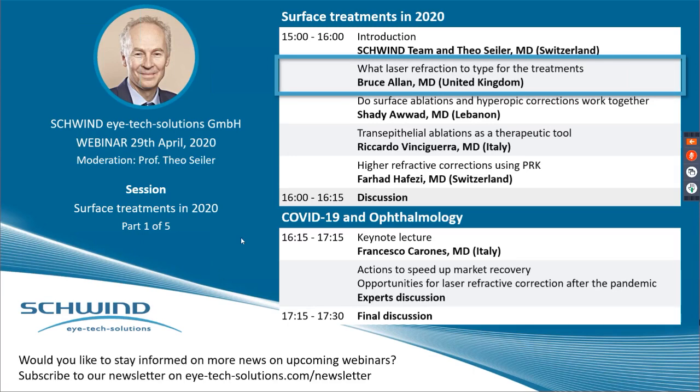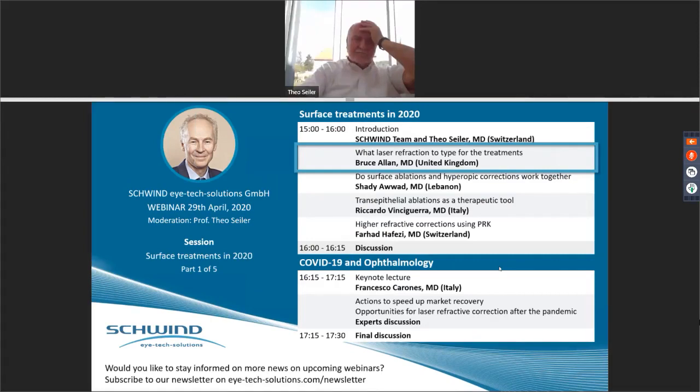So, Theo, I think that the point you just made is important. What we found is that we get lower treatment depth if we use an ocular wavefront guided treatment than a corneal wavefront guided treatment, for the reason that Sam has just mentioned, that we get a compensatory effect from the posterior cornea. But we are able to get good wavefront scanning information from most of the patients in the kind of territory that you are able to help them with the lasers.